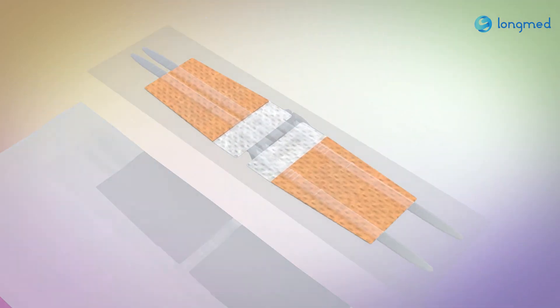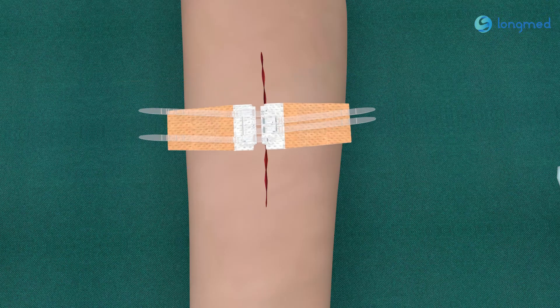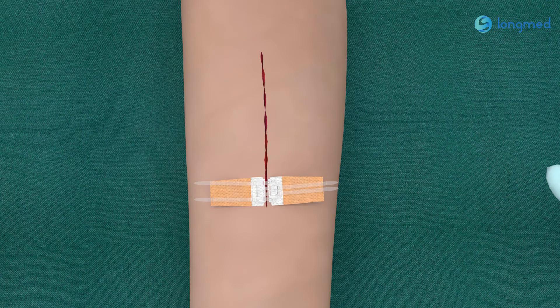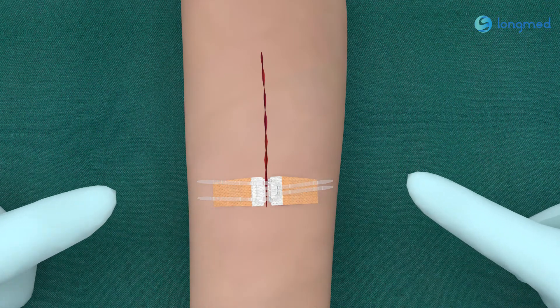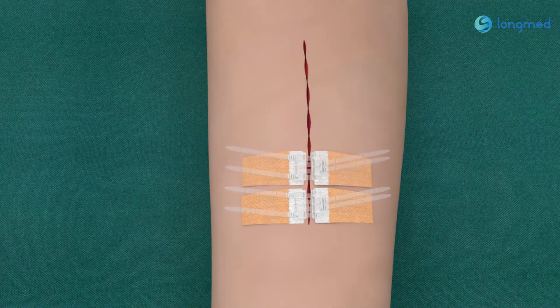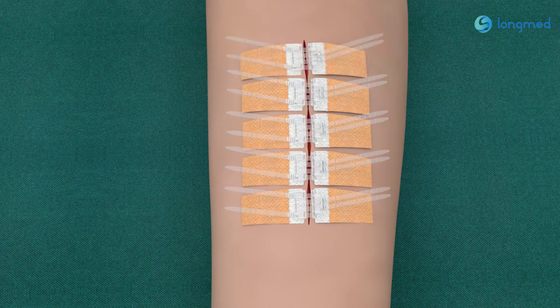Four: open the sterile package and take out the wound closure device. Five: attach the fastener assemblies to the skin on both sides of the wound and ensure that the adhesive is firm. Repeat the above steps and apply another set of wound closure device.